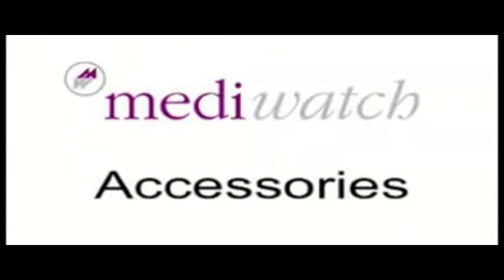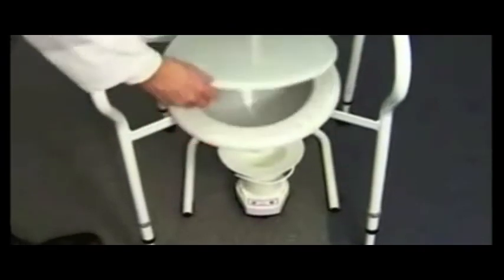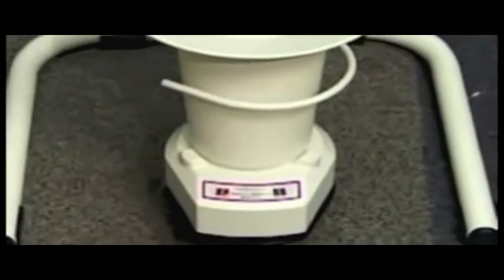MediWatch offers a number of optional accessories designed for different clinical demands. For the wireless spinning disc flow meter, a commode is available. For the wireless weight cell flow meter, options include a urinal option for male patients, a commode option for all patients, and a mobile stool for outreach. The weight cell flow meter is supplied with a frame designed to prevent the pot from being knocked over and to protect the weight cell from bumps while recording. It can be used with a commode for male or female use, or on its own for male-only use.